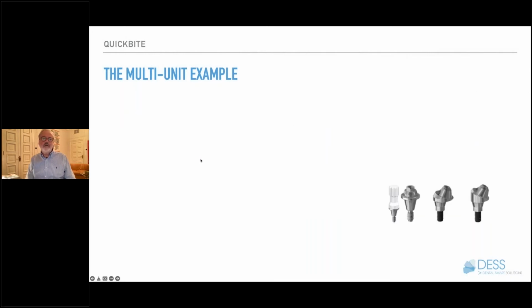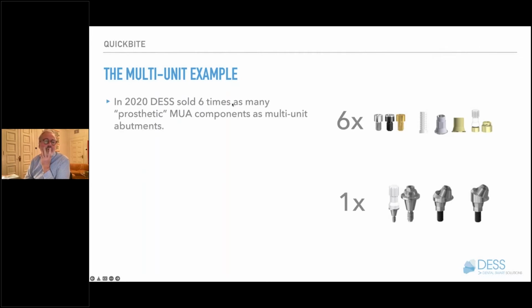The multi-unit treatment consists of a clinical abutment, a multi-unit abutment that can be straight or angled. And then, of course, you have a ton of prosthetic components going on top. That could be the screw, temporaries, castables, tie bases, or in our case, the angle base as well, even an overdenture type of attachment. So you have a clinical component and then you have a laboratory component.